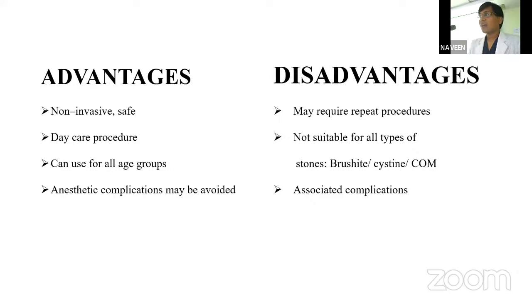Now come to the advantages of the shock wave. Shock waves are non-invasive and safe. They reduce hospital IPD and patient hospital time, because they can be done as a daycare procedure. These waves can be used for all age groups, and they also decrease the need for anesthesia.